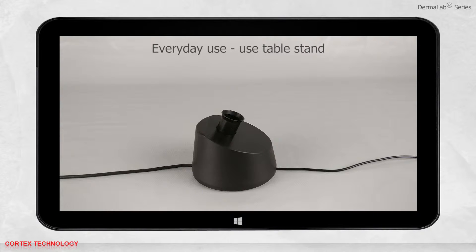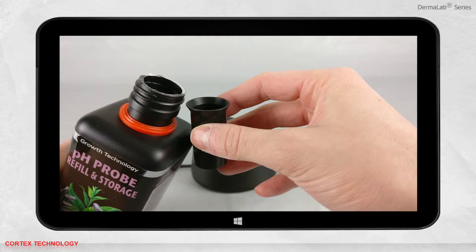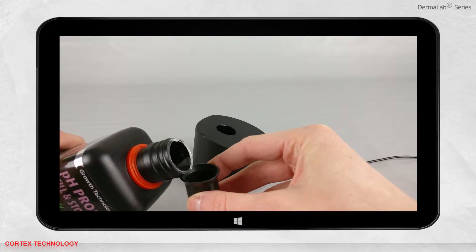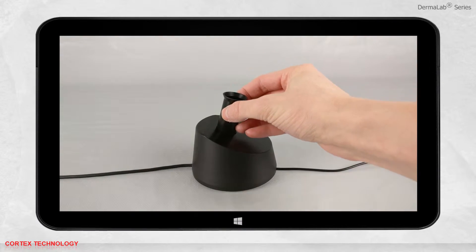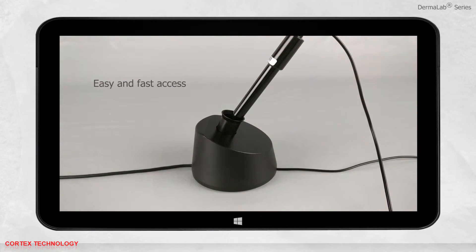For everyday use, we recommend using the table stand. Pour pH storage solution in the chamber until the probe tip is submerged. This will give easy and fast access to the probe.